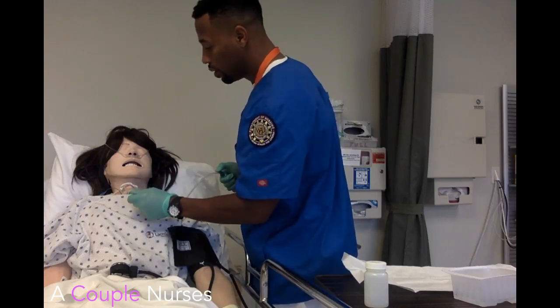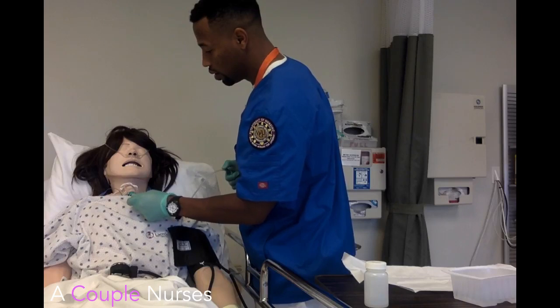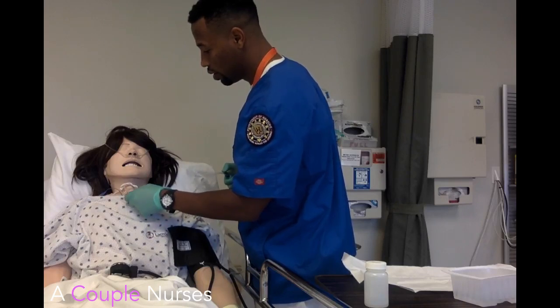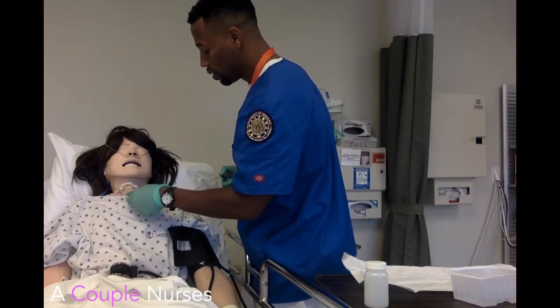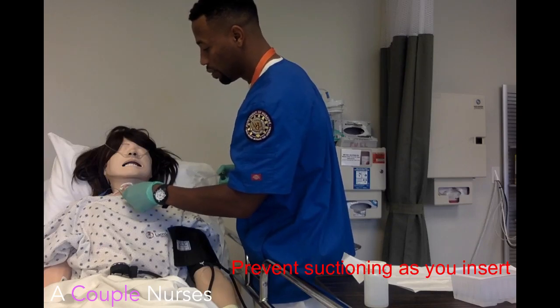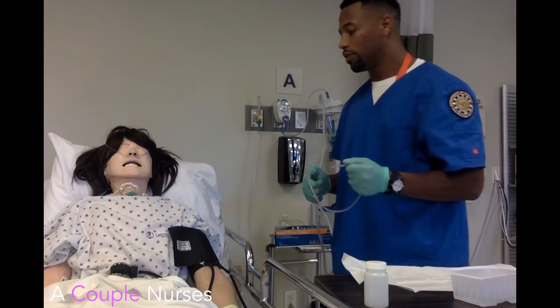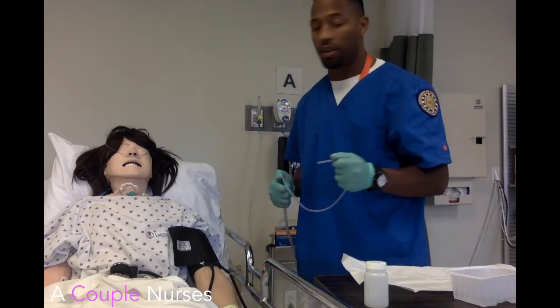All right, so this may feel a little bit uncomfortable, okay? We're going to push in until we get to the carina, then intermittent suction on the way out. The patient has been suctioned; both hands are now dirty. I'm going to let the patient cough and get rid of that discomfort.